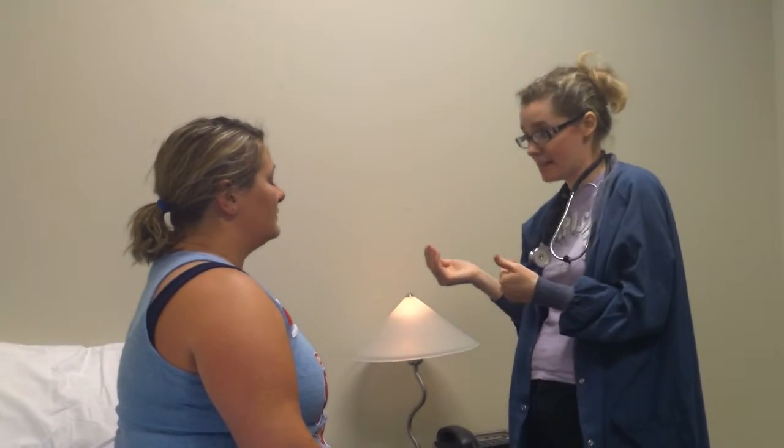Good. I'm going to do a few tests on your eyes. The test that we've done earlier is the Snellen test, which is distant vision. We've also done the Rosenbaum test, which is near vision. We would hold a card 14 inches in front of your face. We would check it uncorrected first and then correct it if needed.